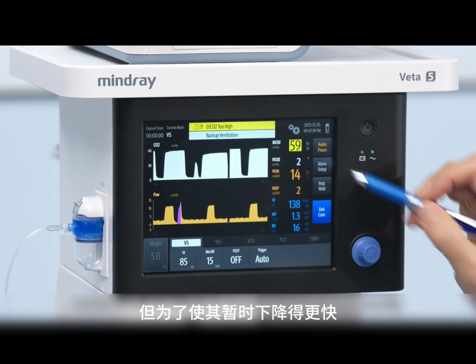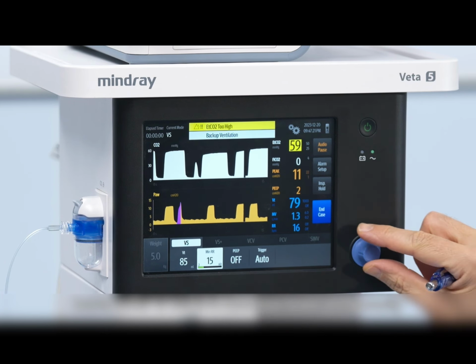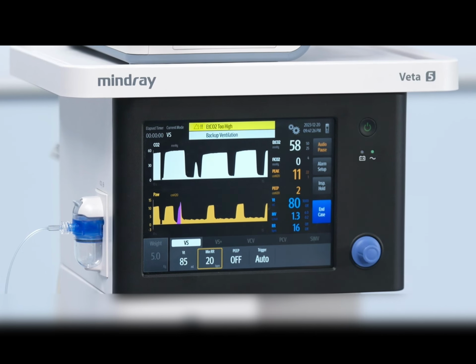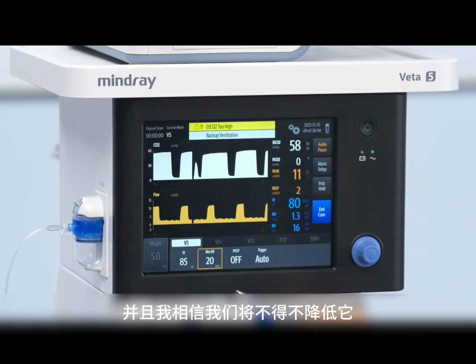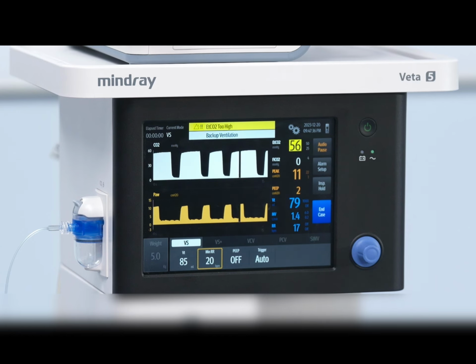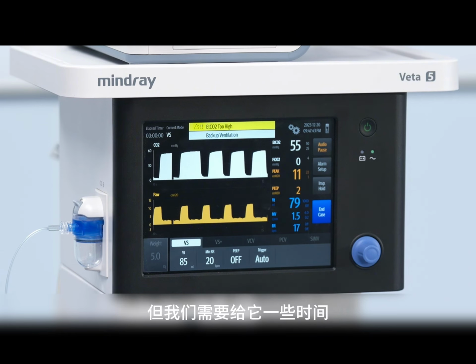But in order to make it decrease faster, temporarily, I will increase the respiratory rate to 20. And I believe we will have to decrease it after the CO2 value came down from these levels. You see the decrease is now faster, but we need to give it a few minutes until the value stabilizes.